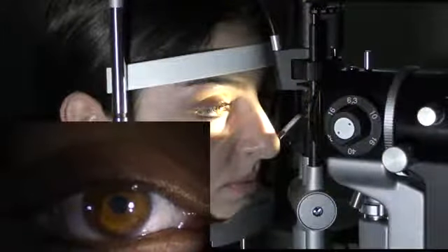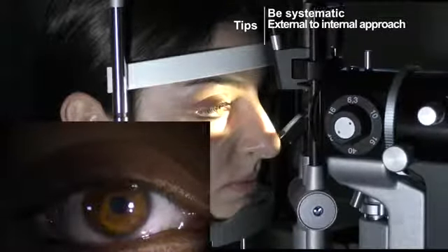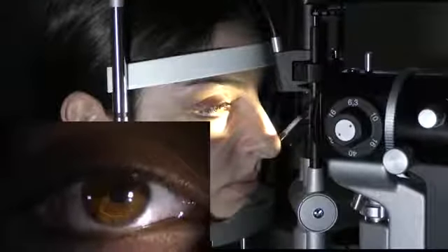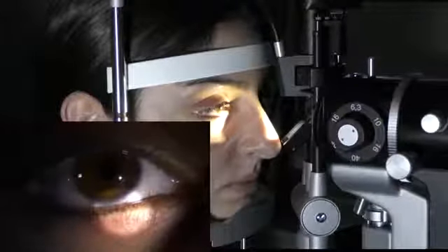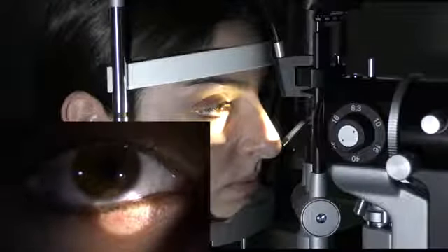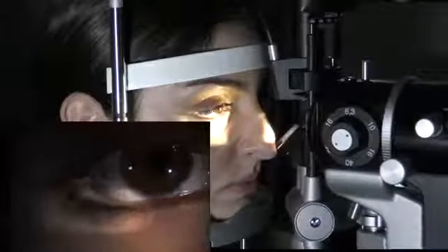Okay, now I'm going to describe my approach to examining the eye. Okay, I like to use a systematic approach from outside in, starting with the structures around the eye. So as you can see here, you can look at the skin just below the lower and upper eyelids, okay? And you want to look for, are there any lesions, for example, any benign or malignant lesions that could be basal cell or squamous cell carcinoma, which tend to be on the lower eyelid. So look for those, do a general inspection, okay?